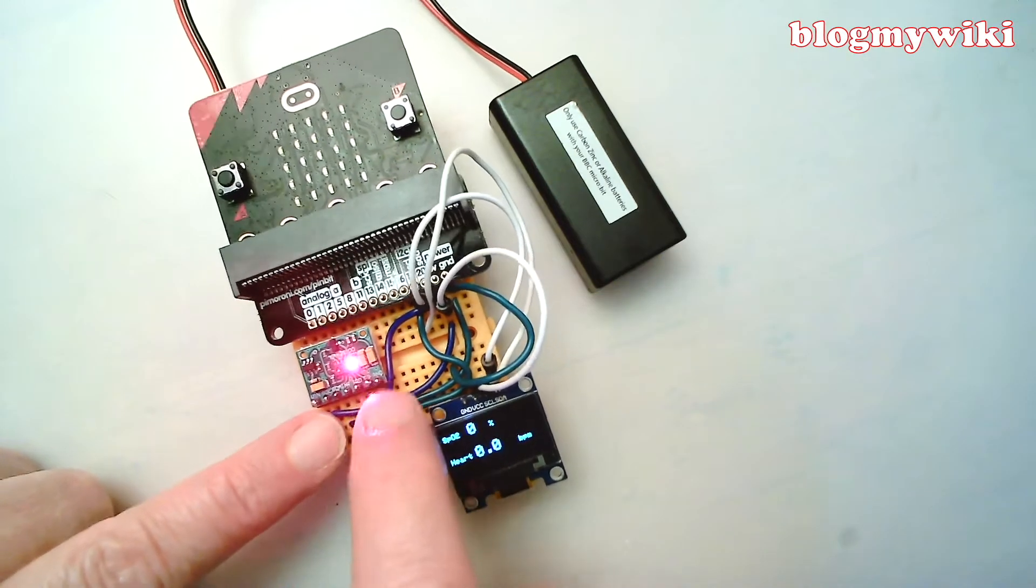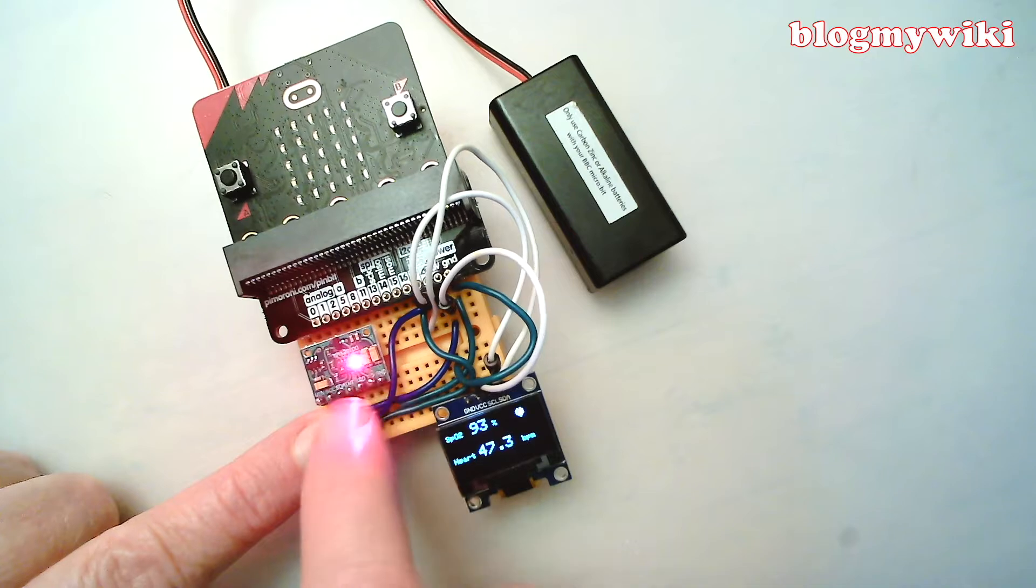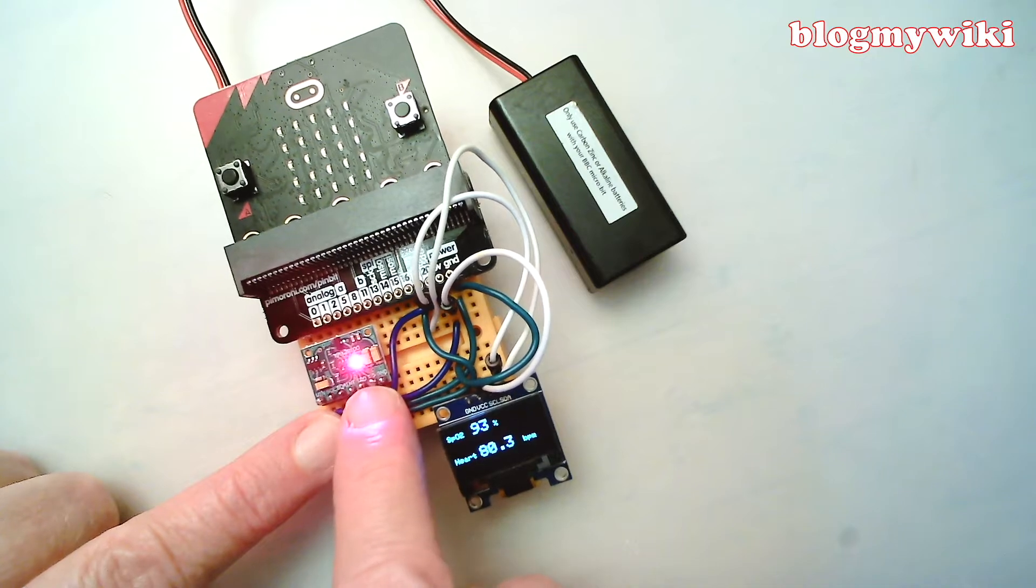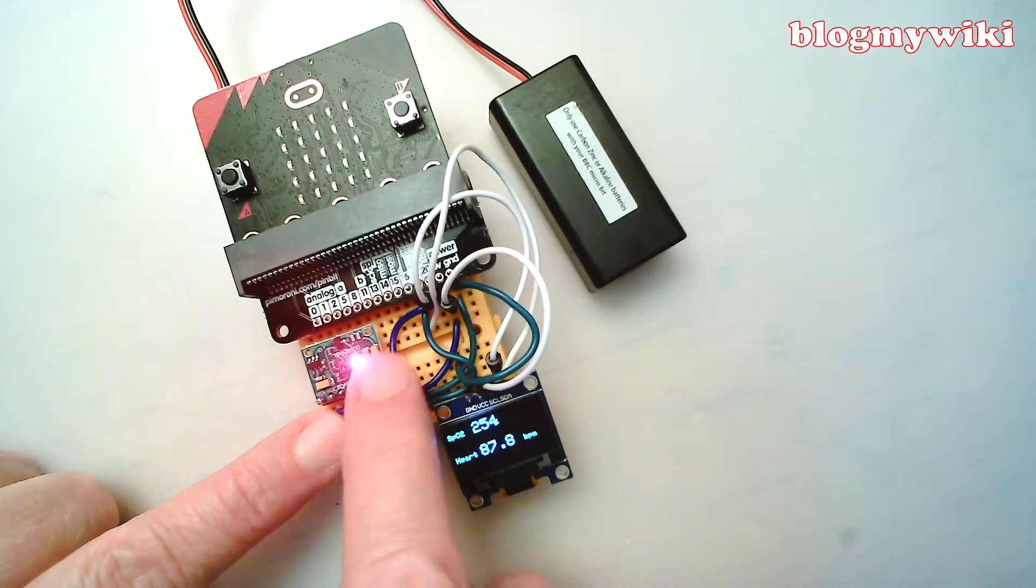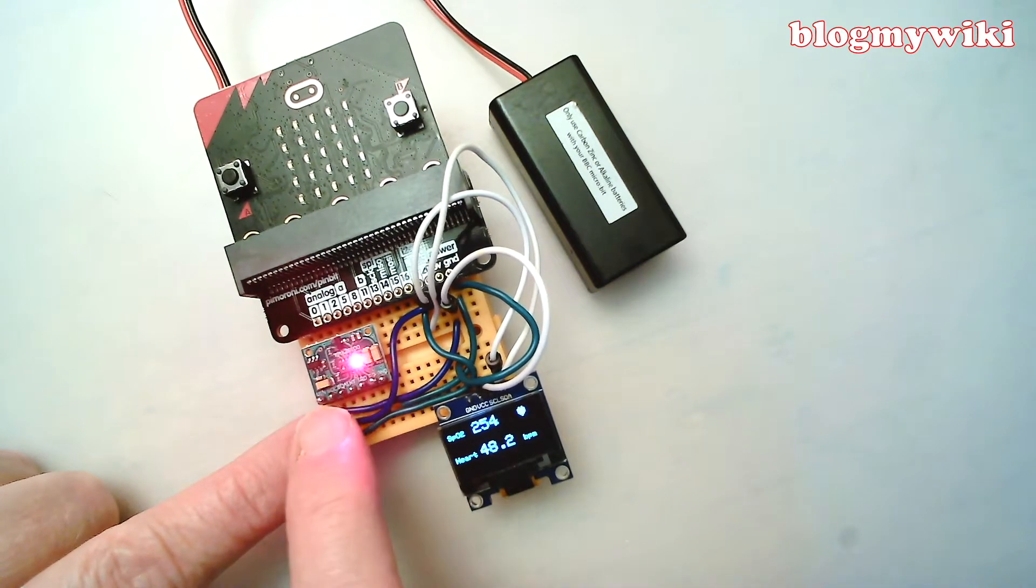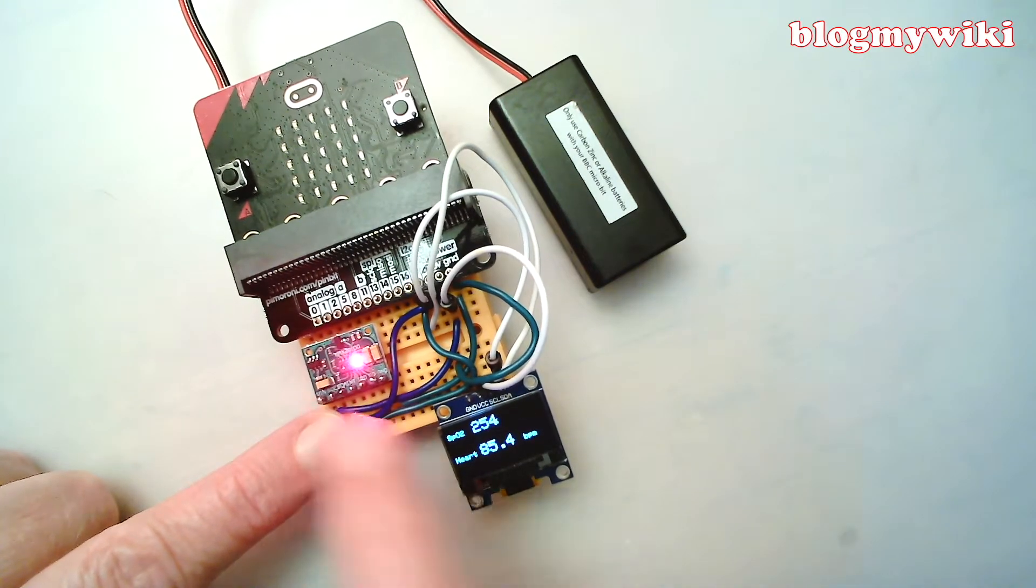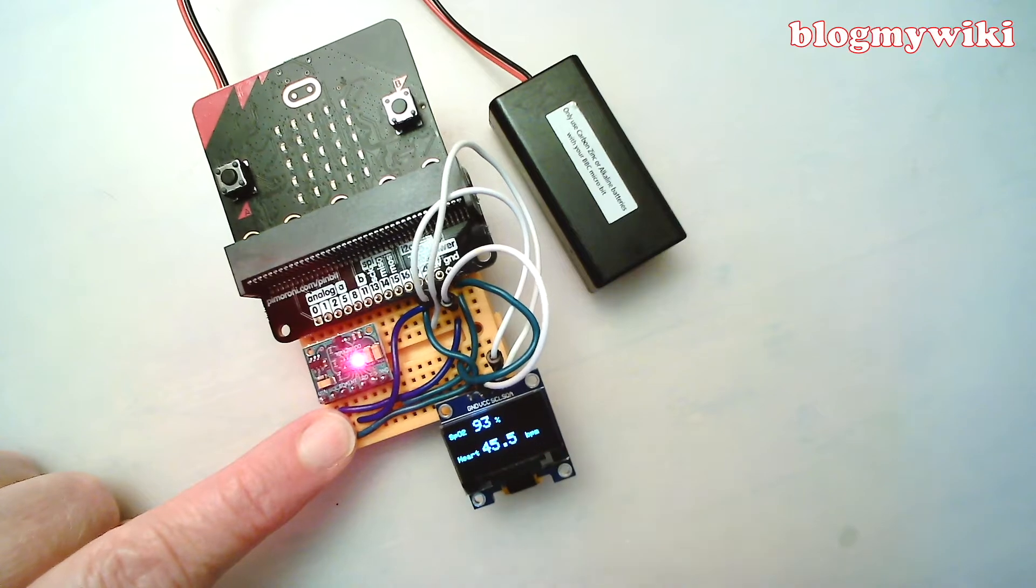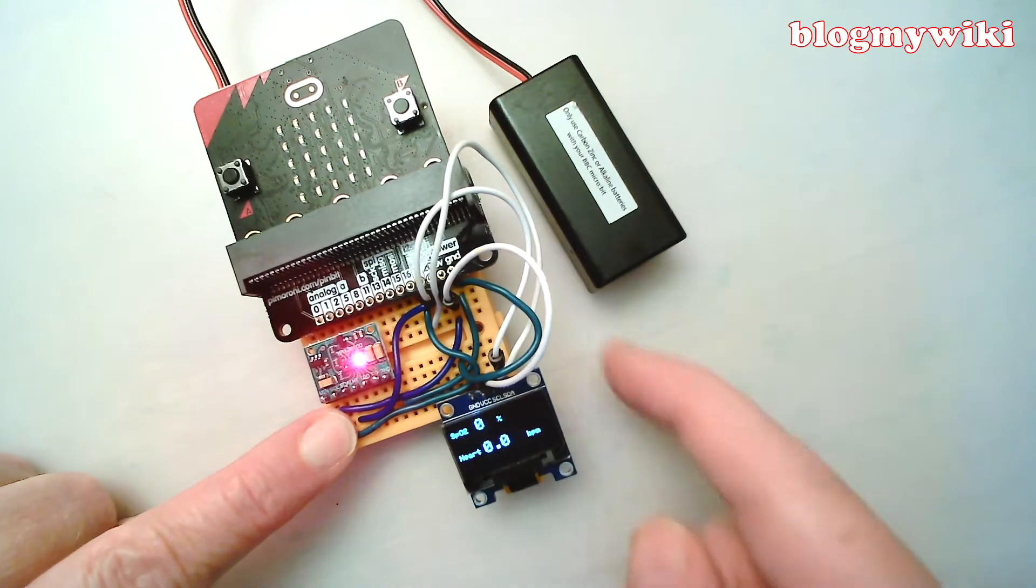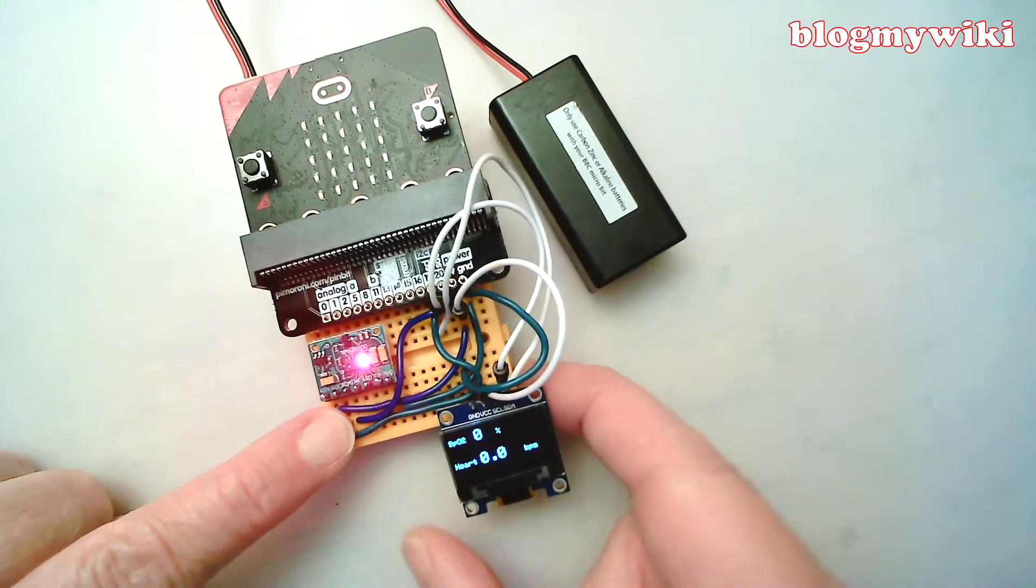A pulse oximeter here, so this measures your pulse and blood oxygen levels. You can buy these for less than five pounds. Also this OLED display as well, they're really cheap, you can buy those for just a few pounds.